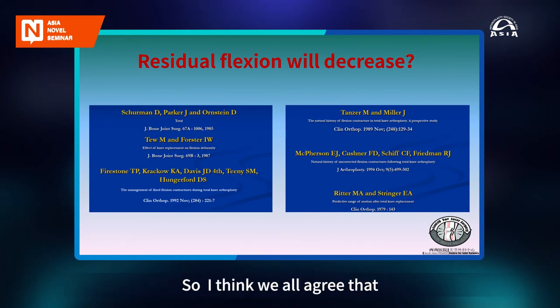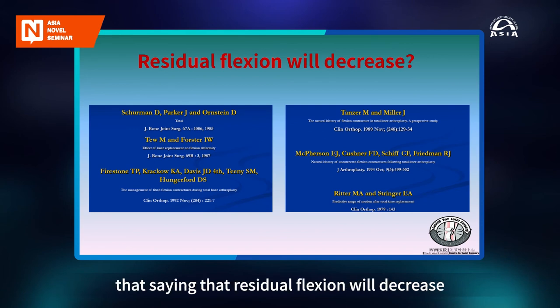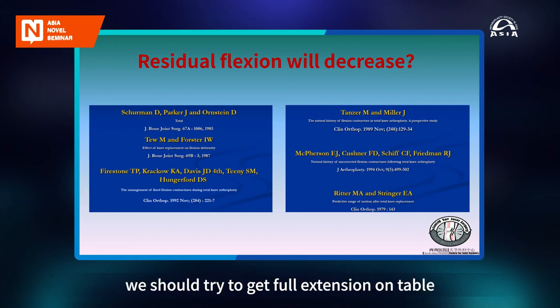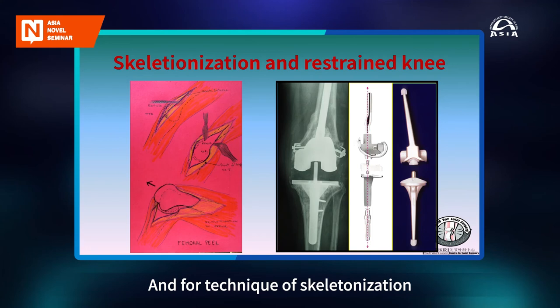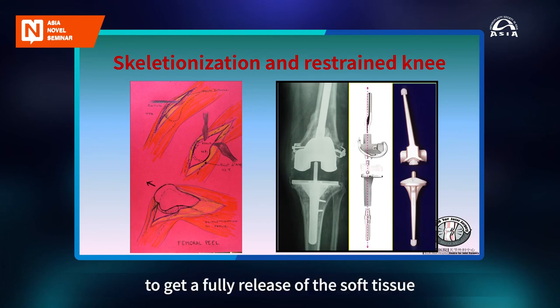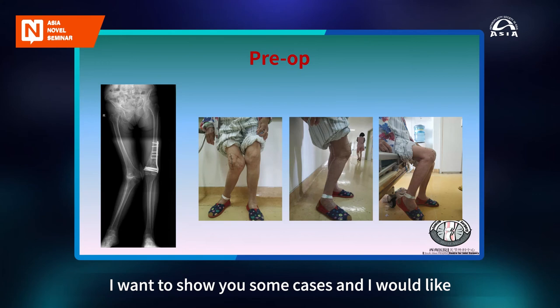So I think we all agree that residual flexion deformity after surgery is not acceptable, although some authors have literature saying that residual flexion will decrease with time after very good rehabilitation. But I think we all agree that we should try to get full extension on the table. And for the technique of skeletonization, for some severe flexion deformity combined with varus or valgus deformity, sometimes we need skeletonization to get a full release of the soft tissue. And most of the time, we need a more constrained knee, like a CCK or maybe a hinged knee, to do this. I want to show you some cases, and I would like to hear your comments about these cases.